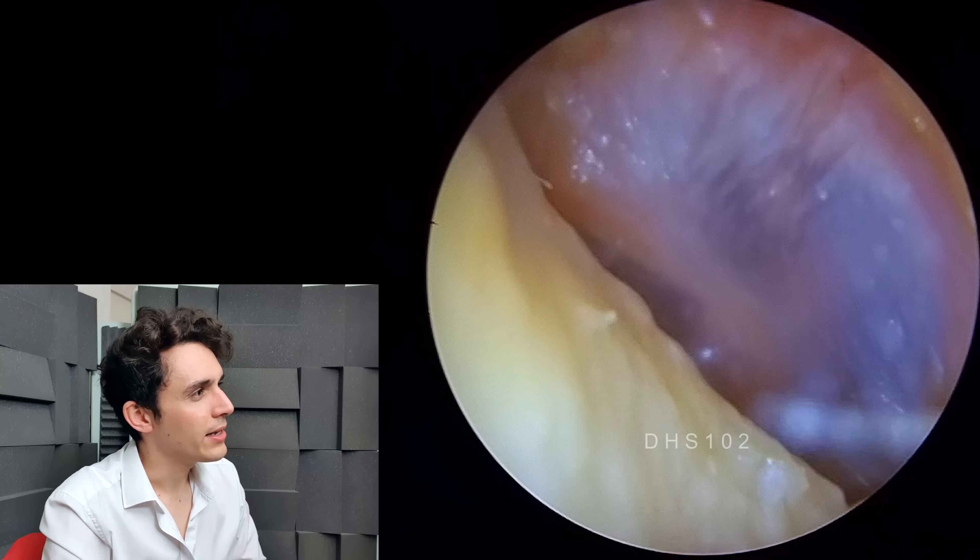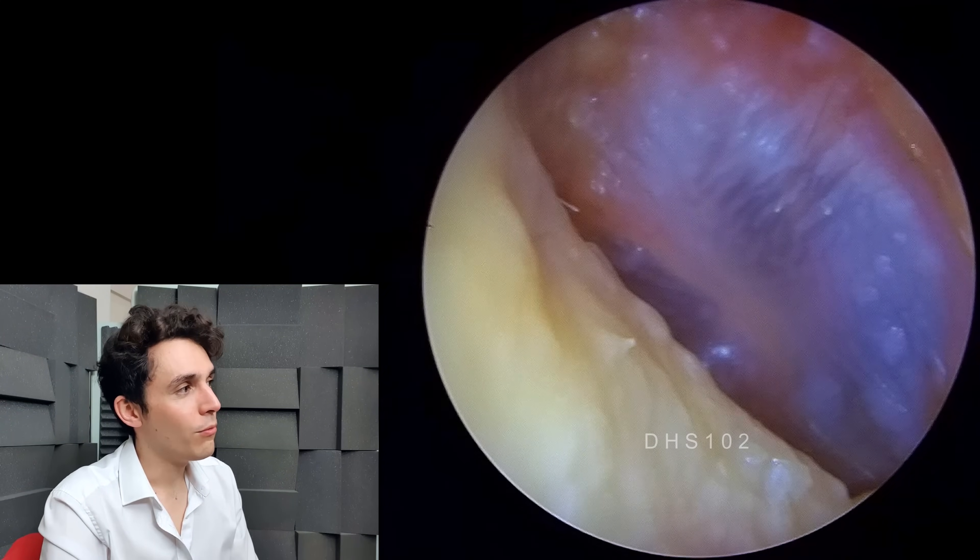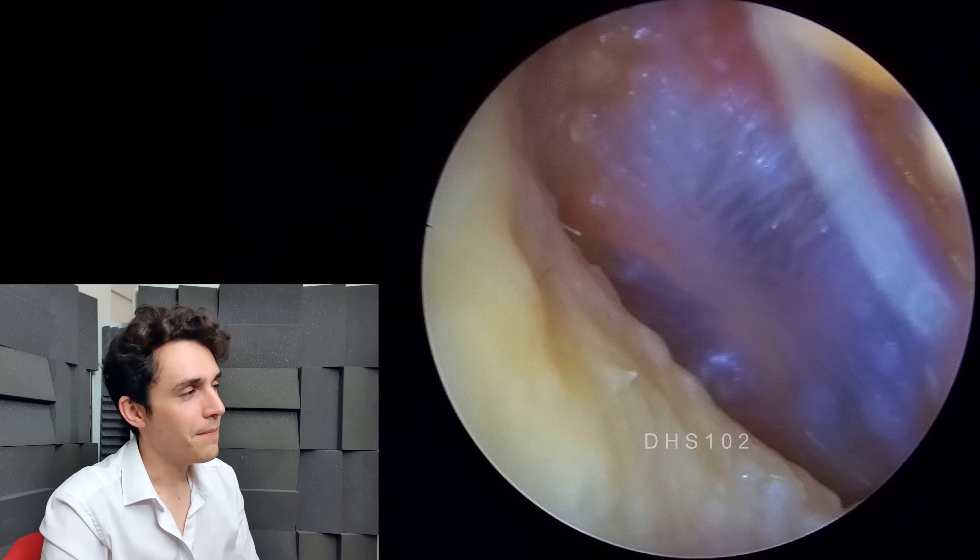Watch the eardrum just back here. What I've asked her to do — sometimes I do this at the end of a procedure — is get the patient to pinch their nose and then try to blow through their nose. If you've ever been diving, you'll know what I'm talking about. When you try and do that, it's called a Valsalva maneuver. Because the air has nowhere to go, it shoots up your eustachian tubes to your middle ear cavity. Because you're inflating the middle ear cavity, the eardrum deflects outward. This tells me that the patient isn't congested.